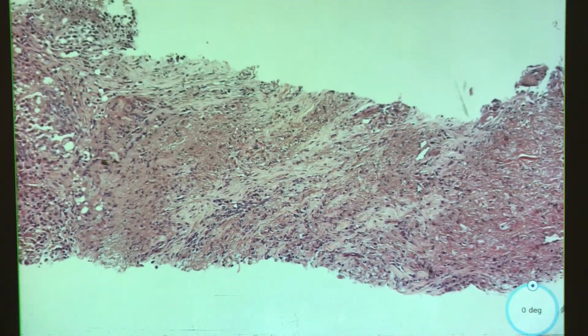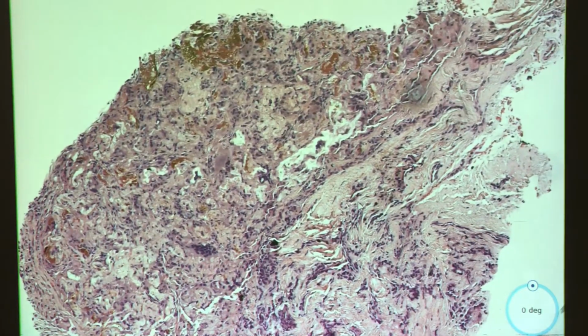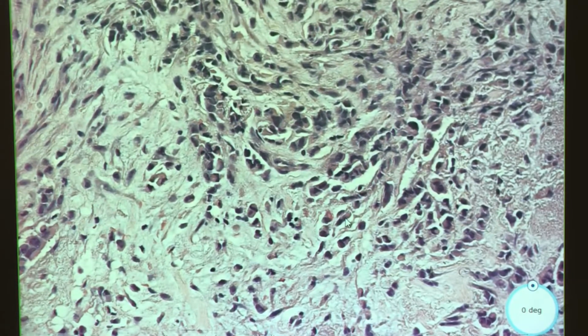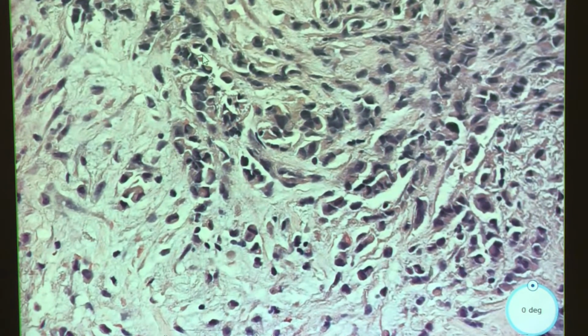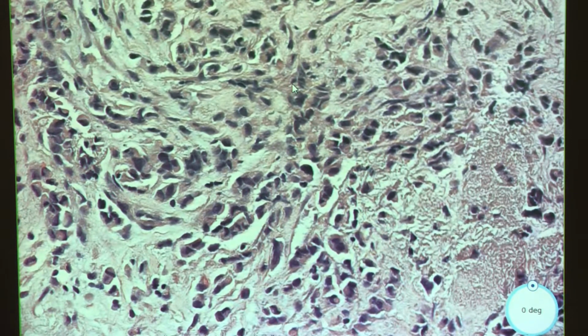And so this one, I feel comfortable calling a grade 2 lobular. Looks like we have some biopsy change. Maybe this was an area they had sampled before. But the pleomorphism is a little too much. The cells, there's definite differences between them. So going 3 for tubules, 2 for nuclei, and 1 for mitoses is giving us a 6. So this is a grade 2 invasive lobular carcinoma.